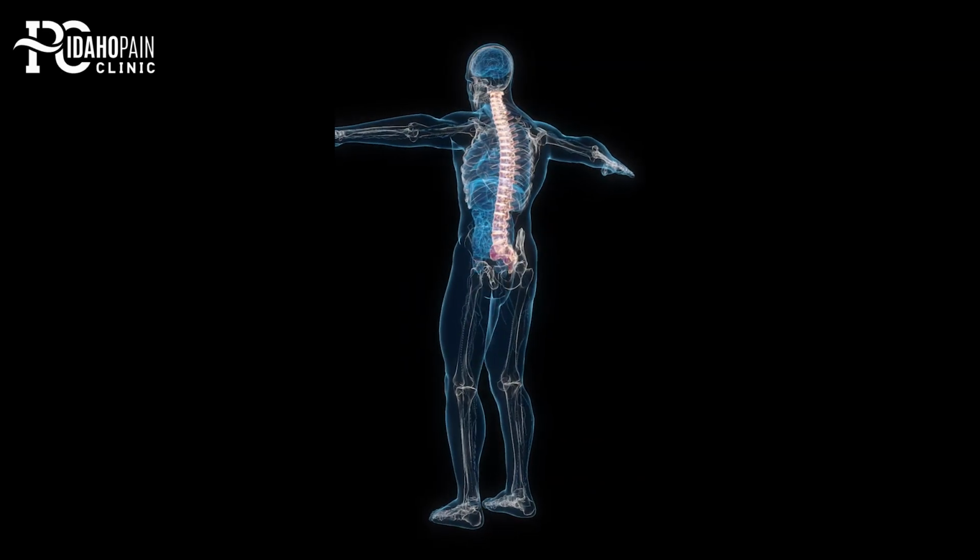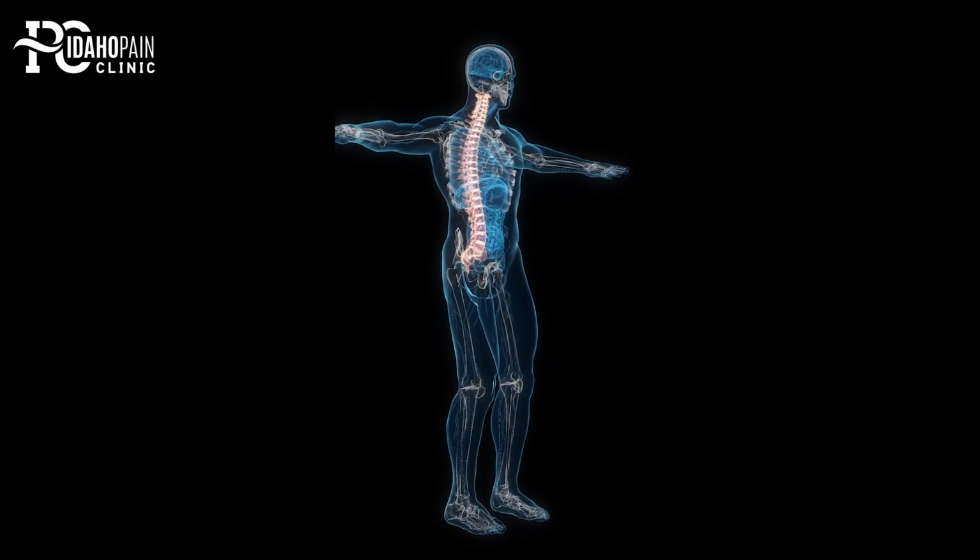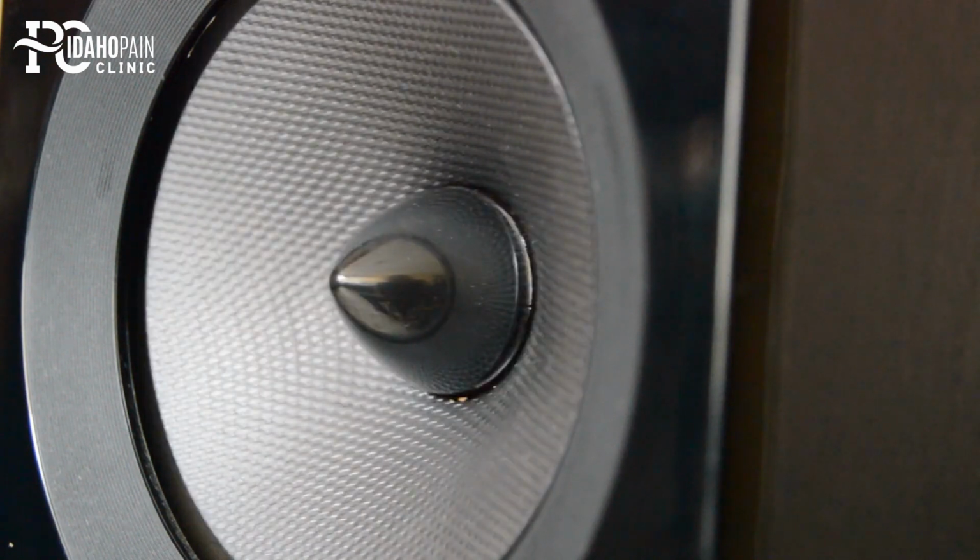If you think of the way your body is wired, you've got your brain going into your spinal cord and then going into the extremities. Well, when you have a pain signal coming from your leg going to your spinal cord and up to your brain, it continuously shoots this pain signal. So what a spinal cord stimulator can do is stimulate that and basically inhibit the body's ability to transmit that pain up. Think of it almost like white noise. Sometimes if your neighbors are real loud, you'll get a white noise machine and it washes out the noise, and instead you have this white noise. It works in a similar fashion.